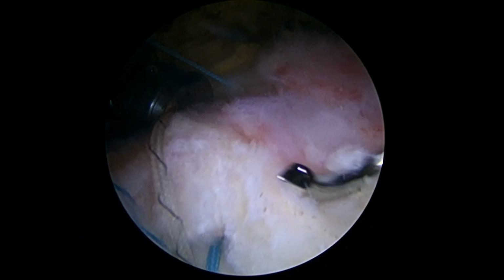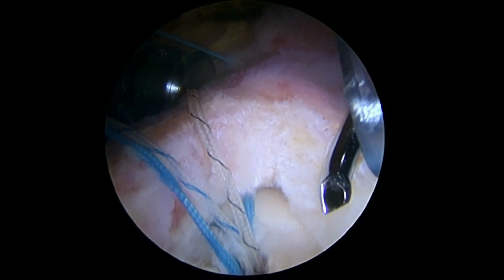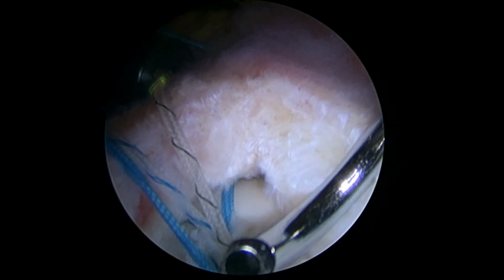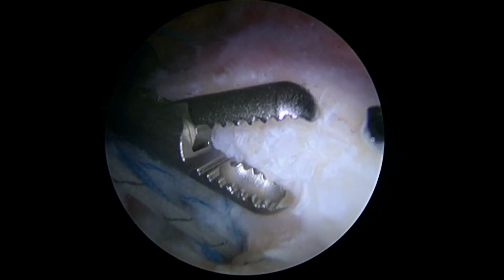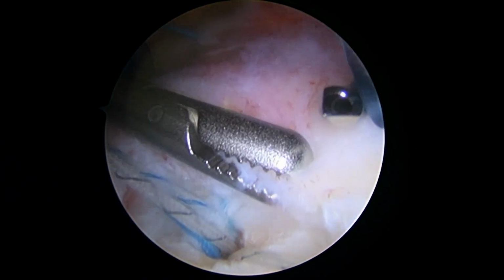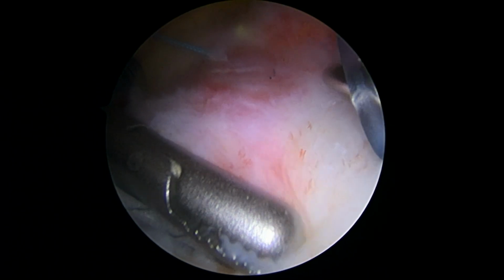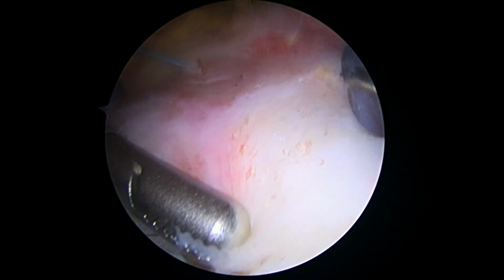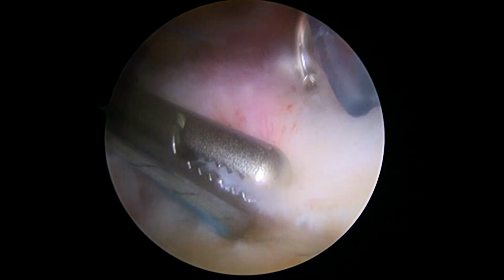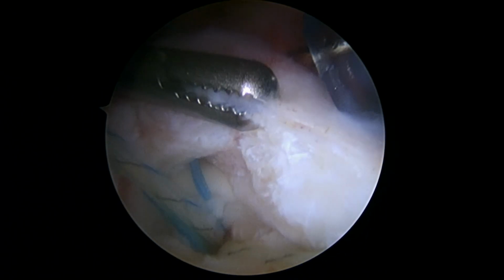Okay, so now we're going to place our final stitch. This hook goes the opposite way. It's what we call a turn to the left. And just like we did on the last one, we're going to grab the tendon a little bit, see what it looks like reduced, and then backtrack so we know we want our stitch right about here. Let me do it one more time. Okay, pause.